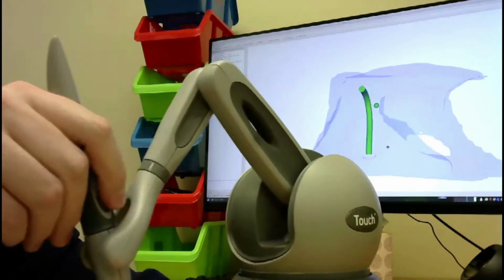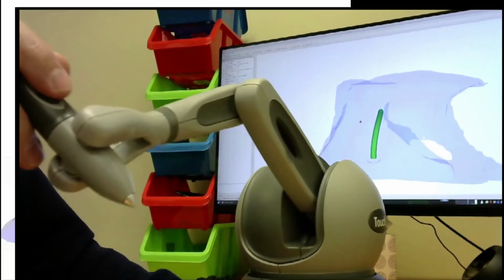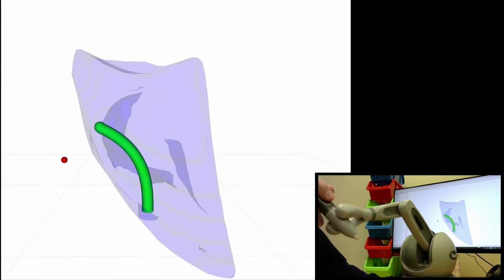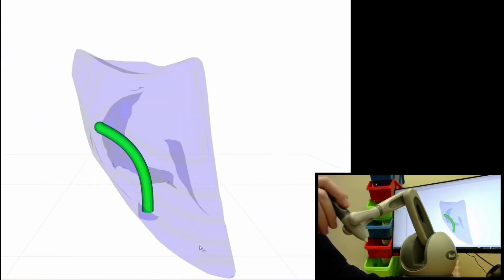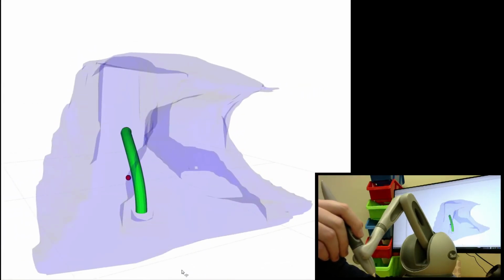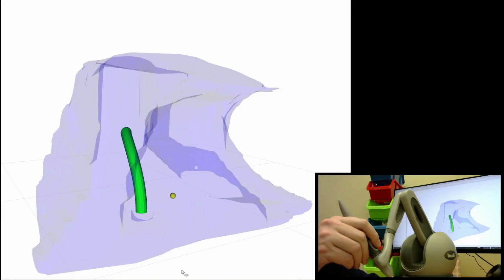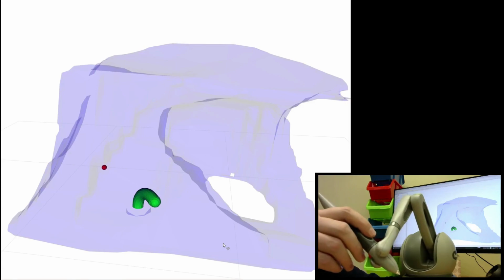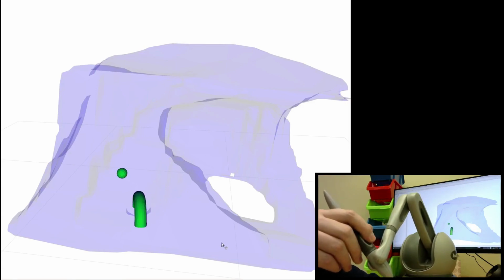Here's an example of supervisory control with a haptic input device. The small sphere is the tip of the haptic device. The user clicks the button on the pen to set the goal to the current haptic tip position, as seen by a large sphere appearing. We can qualitatively visualize the planning time as the delay between the large sphere appearing and the beginning of the robot motion.